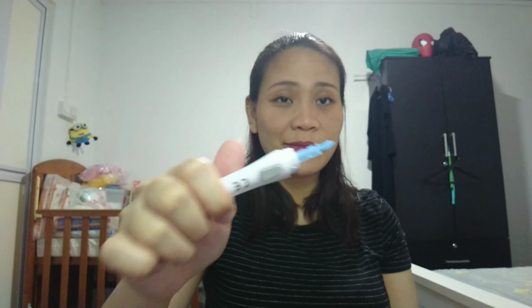Okay, I don't know if this is correct, but I need to see the instruction. I told you, I haven't read this. Twist and pull to remove the lancet protector. Okay, this one is much more complicated than the AccuCheck. So you need to twist the cover, and there is the pin. Can you see it? There. And then you need to put back the lid.